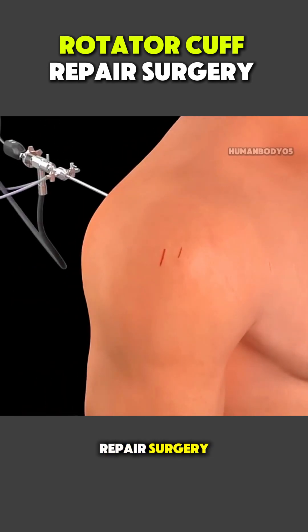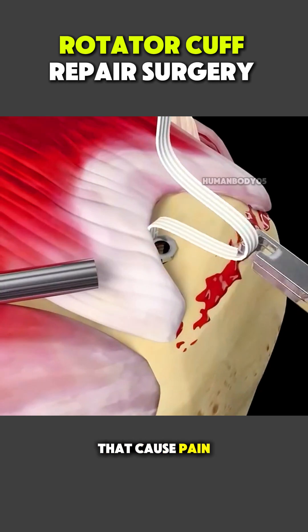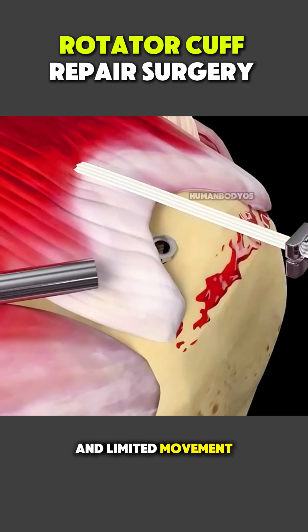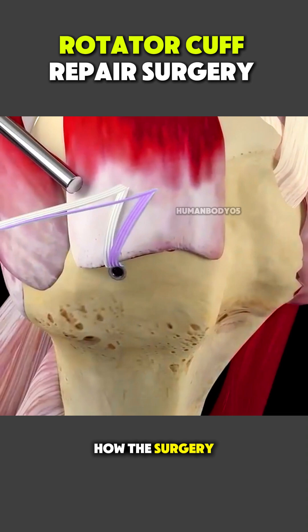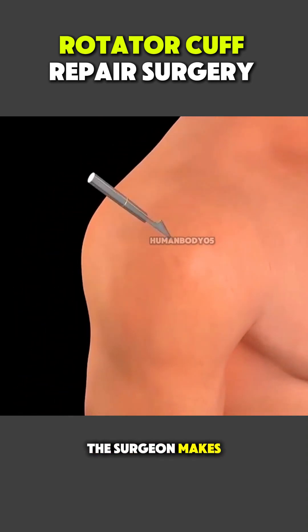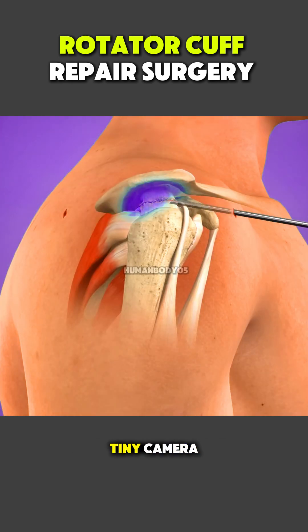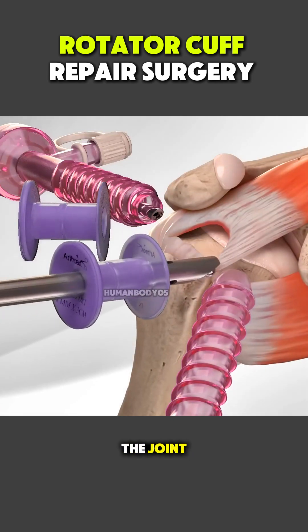Rotator cuff tear repair surgery is done to fix torn tendons in the shoulder that cause pain, weakness, and limited movement, and here's exactly how the surgery works. After anesthesia is given, the surgeon makes a few very small incisions around the shoulder and inserts a tiny camera called an arthroscope to see inside the joint.